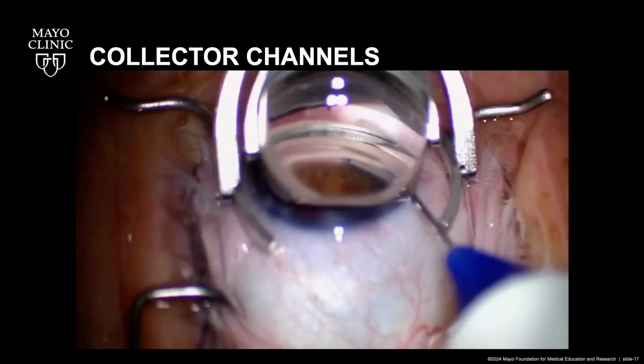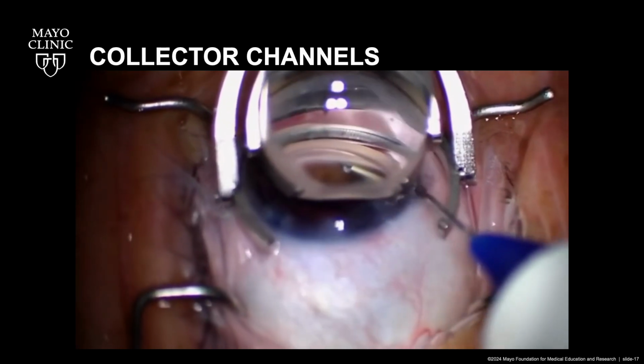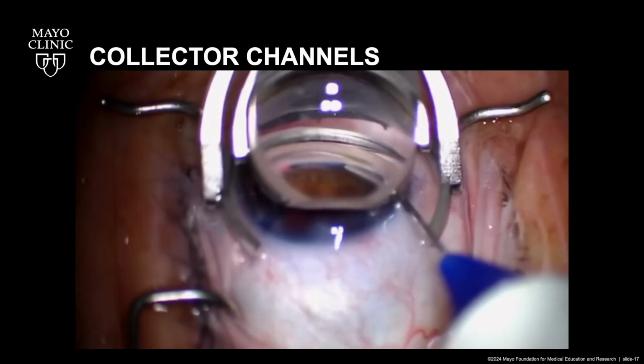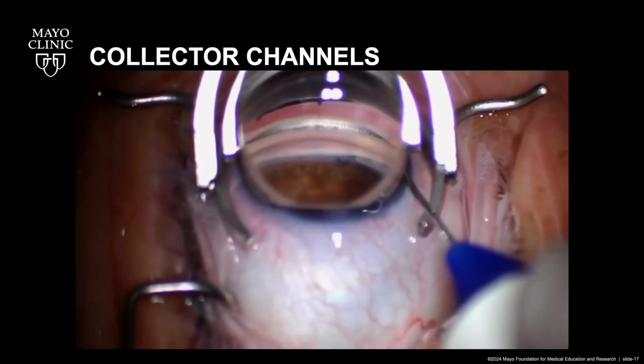So in this video, we'll go ahead and see what some of the collector channels look like. As we saw in the previous video, the canaloplasty is done here by moving the catheter through Schlemm's canal, dilating it, and then it's retracted as it releases viscoelastic fluid into Schlemm's canal.